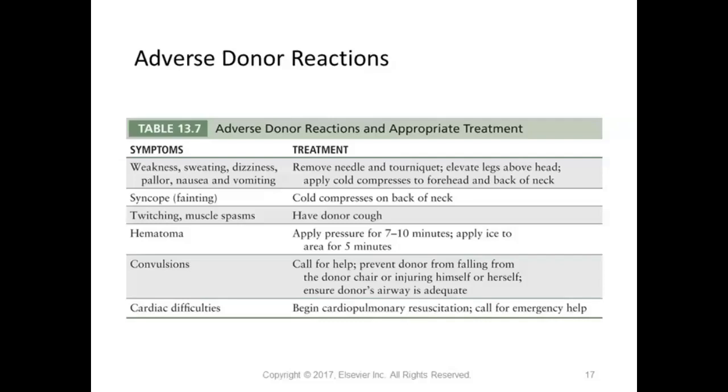In 10 minutes, your blood should clot, where your body should form a platelet plug to stop the bleeding, and you're pretty much good. But that's with the small needle. The 16 gauge is much bigger and needs more pressure for a longer period of time.